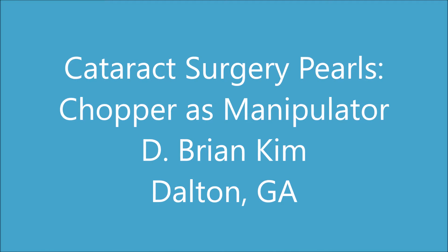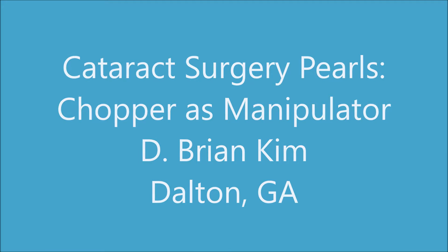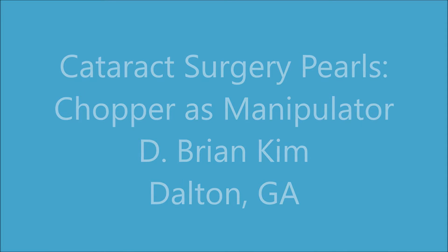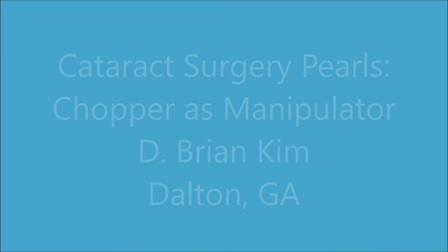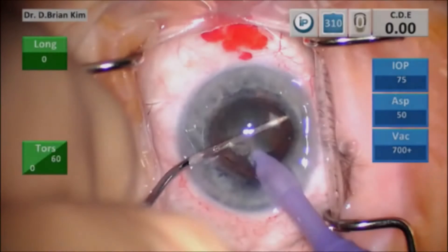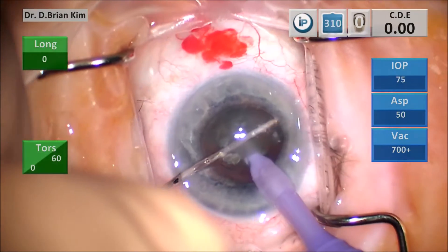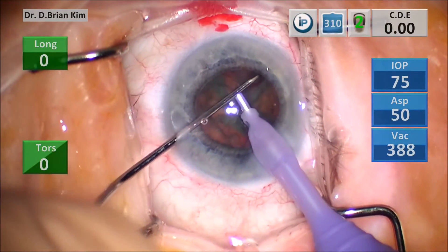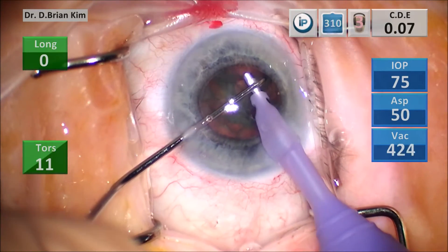When doing lens manipulation, you may have soft lenses with very sticky epinucleus, making it difficult to mobilize the endonucleus. I'm going to show you some examples of that, followed by examples of mobilizing epinucleus. In these cases, sticky epinucleus is preventing the endonucleus from coming out. After my cross chop, I'm trying to grab that quadrant but it's not really working.